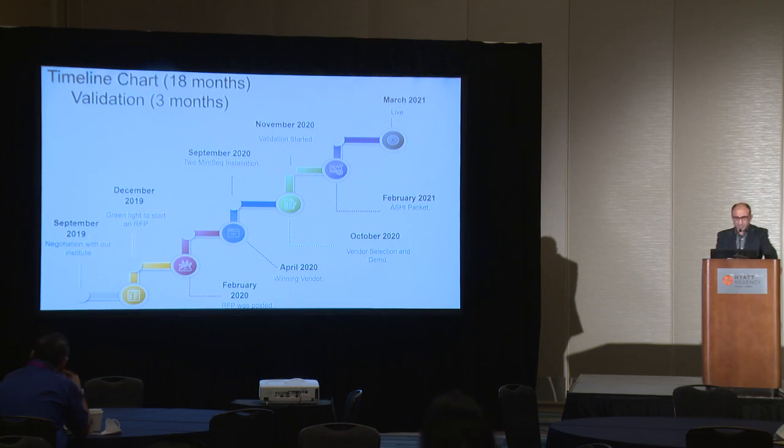You also have to start negotiation with your IT, because at the beginning I thought that IT is just one person, but then it became a committee and there were over 20 people from different IT departments: security, safety, certificates, storage, applications, like a lot. And you have to convince the 20 of them that your product is safe and secure for the patient health system.